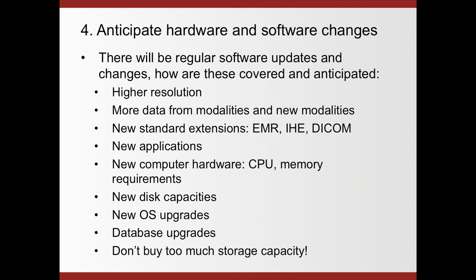Now, when I look at some of the systems in hospitals, in many cases the owner of the system will be very proud, show off this big cabinet and say, listen, look how many terabytes I have here. That will take care of the next 5 years of storage. And I always have to wonder, why would you ever want to buy 5 years of storage? Because that means you have definitely paid too much, because the next year you can probably double the amount of storage for half the price. So don't buy too much.